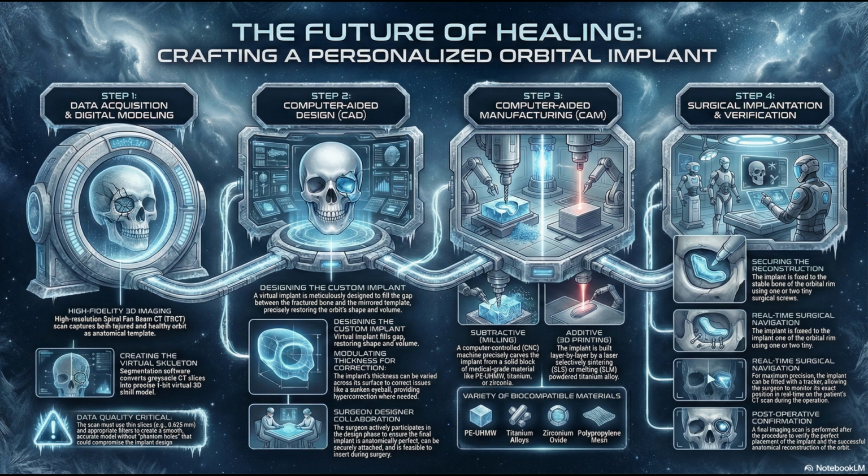Exactly, and when the software can't see that thin, bony barrier, these pseudo-defects basically merge the orbital space with the sinus next to it, the maxillary or ethmoid. And here's the critical point. That eliminates the boundary. If the computer can't define the edge of the bone, it can't define the size or shape of the hole you're trying to fix.